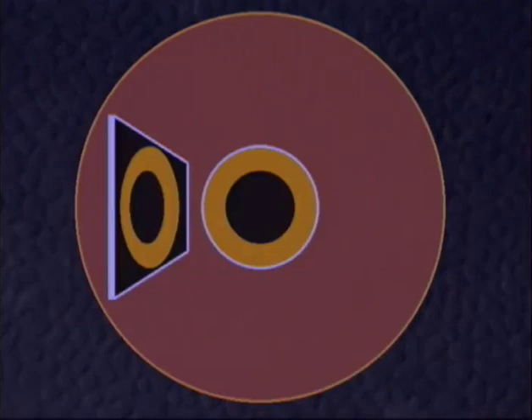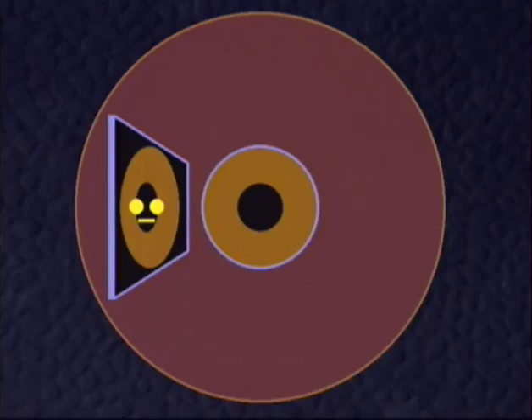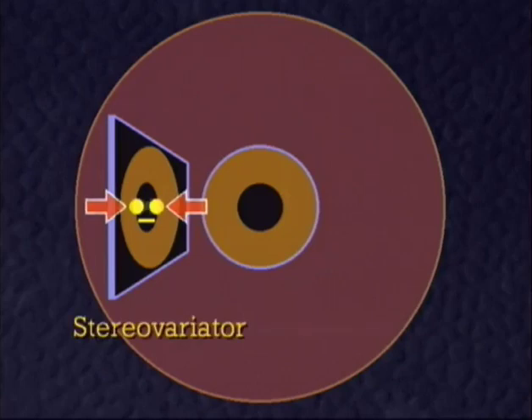Obviously, with a narrow pupil, the difficulties of passing 3 bundles increases. The critical parameter is the distance between the 2 bundles of the microscope. Therefore, the access through narrow pupils can be improved if this distance is diminished by special optical devices such as the stereovariator.